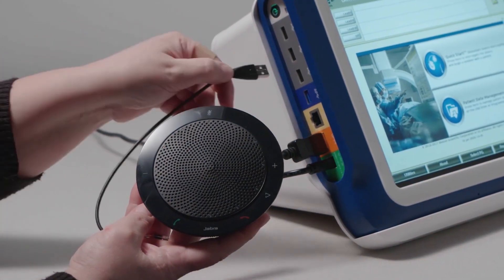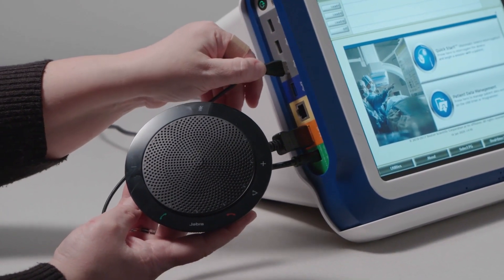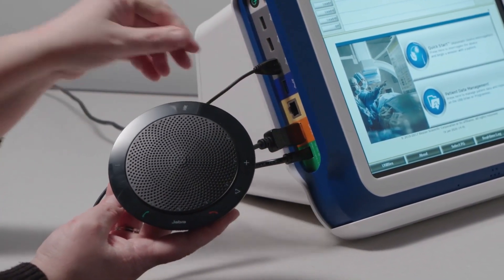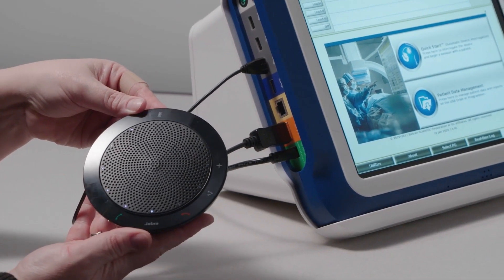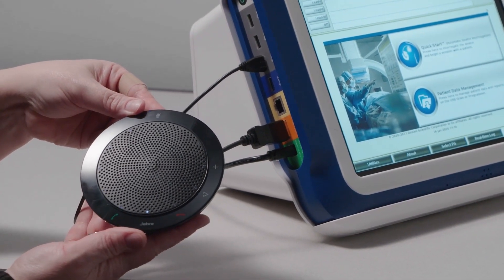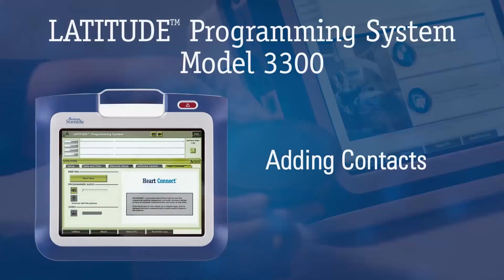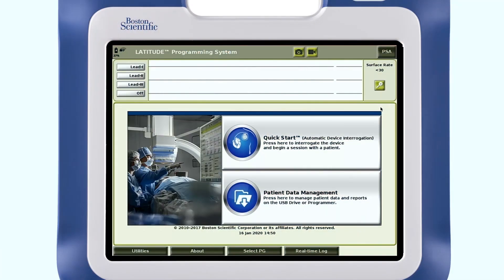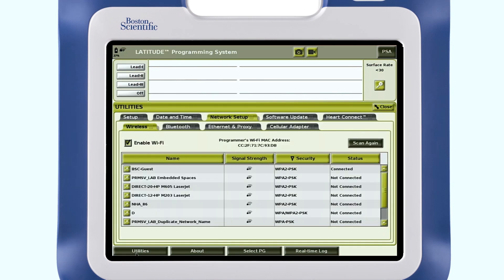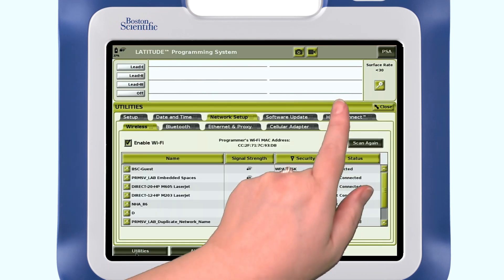Now that you have an internet connection, connect the external USB speaker and microphone into a USB port on the programmer. To access the HeartConnect application, navigate to Utilities and then the HeartConnect tab.